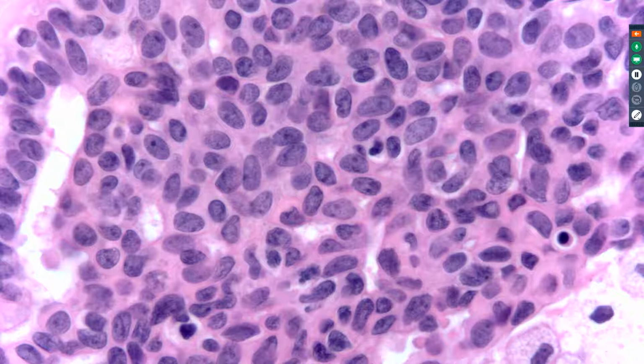And what you have is what I term a polymorphous population. It's not pleomorphic, it's not wild anaplasia cells, but the cells are variable. So the population shows some slight variability. It has a little bit of a jumbled and disordered look to it. There's just a little bit of randomness to it. The nuclei are predominantly oval. Some of them might be more round in their shape if you cut through the waist, but generally it's an oval nuclear population.